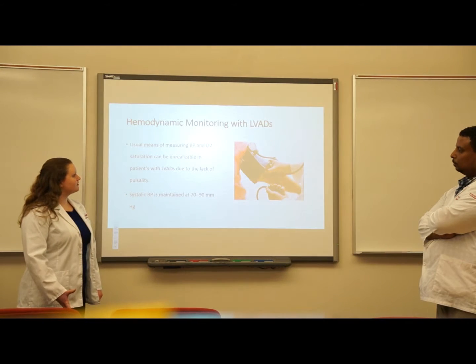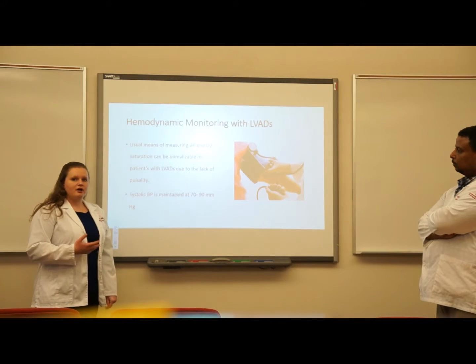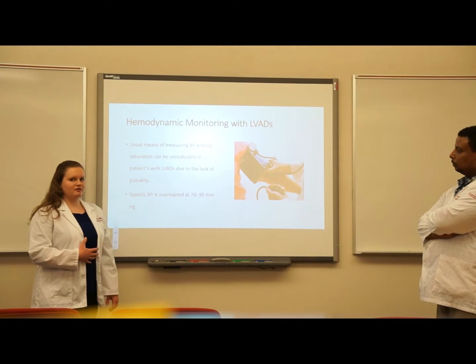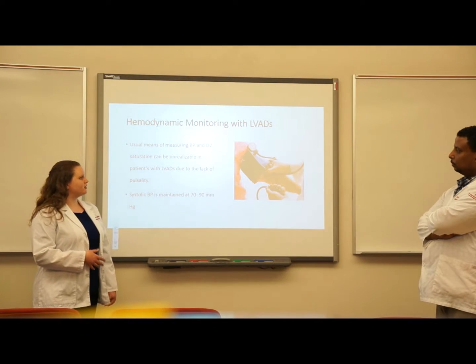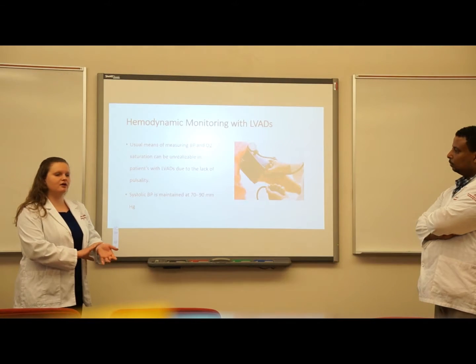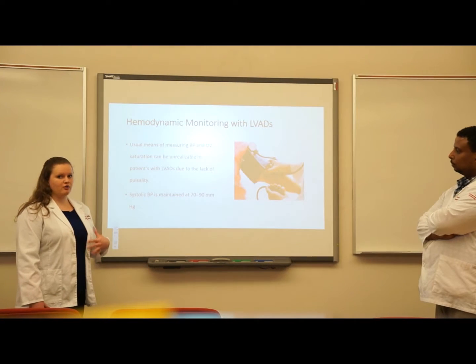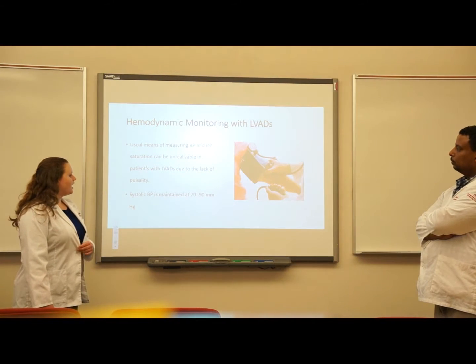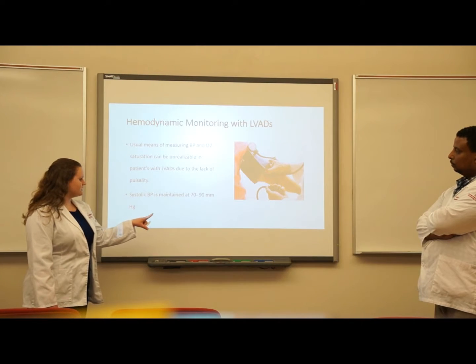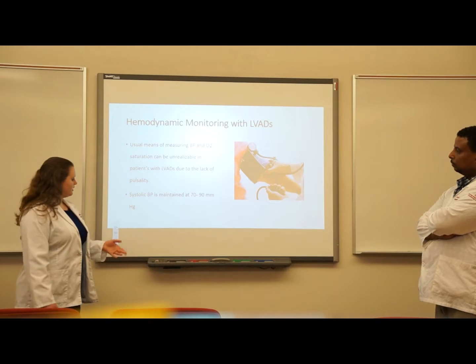The usual means of measuring blood pressure and oxygen status aren't as accurate as with a regular patient, because LVAD patients don't have a lot of pulsatility, meaning they don't have a strong pulse due to the continuous flow of the pump. Their systolic BP we try to maintain at 70 to 90, and they won't really have a diastolic blood pressure due to the pump.